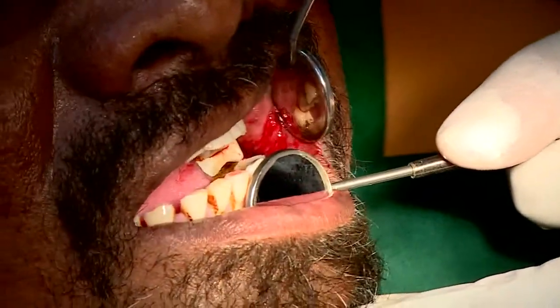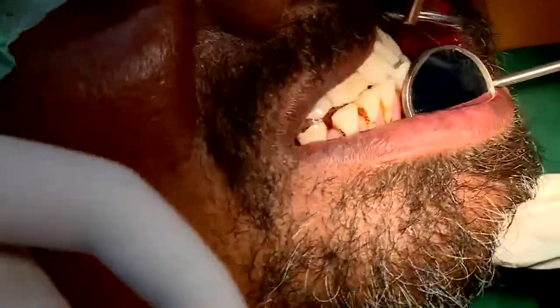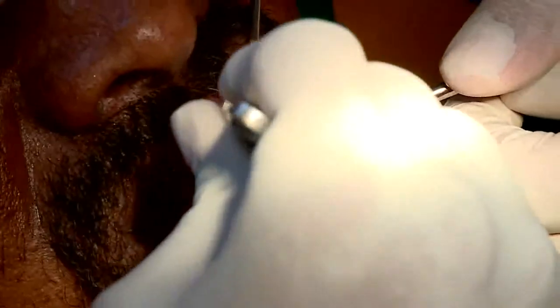Yeah, I agree with that, Doc. Even if you place suction tips directly on the tissue, that can also induce artifacts, vaporization artifacts. So place the suction tip well away from the tissue of interest.